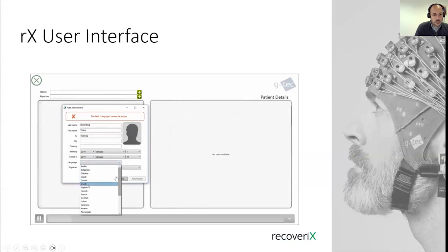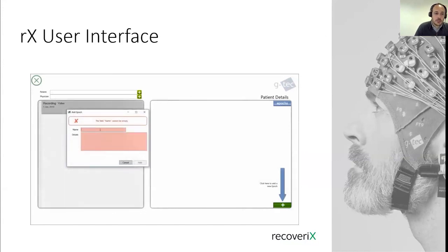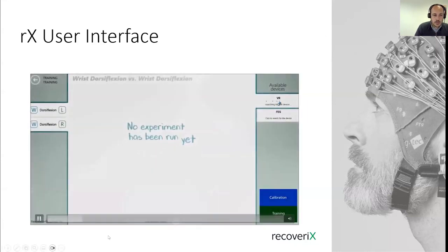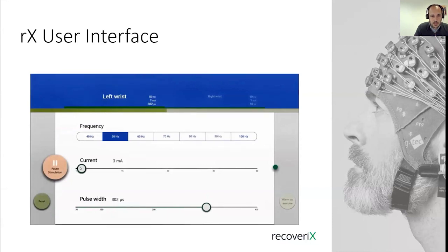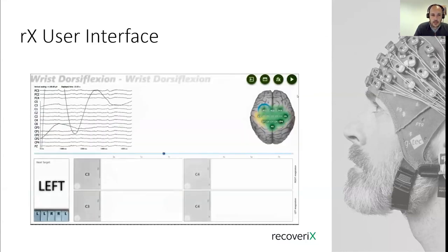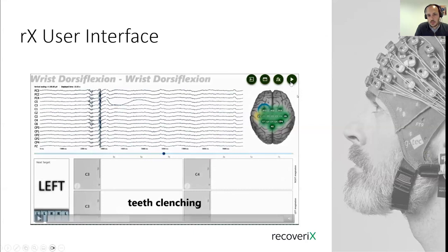You also have to select the language. And we add the epoch information. It's a short description. And then we are able to start the therapy, right? So start the virtual reality. We adjust the current parameters. And then we can go to the session. And then the only part that is required is just to start the session with this start play button, right?